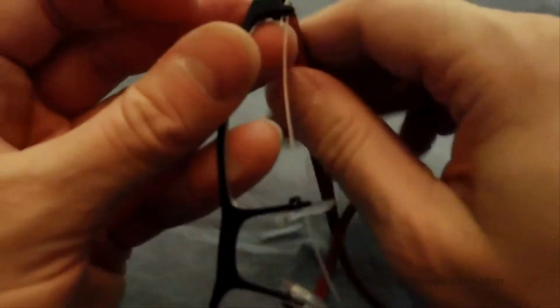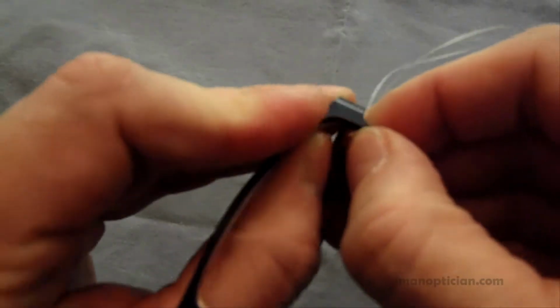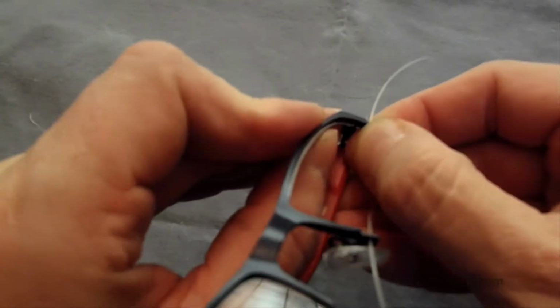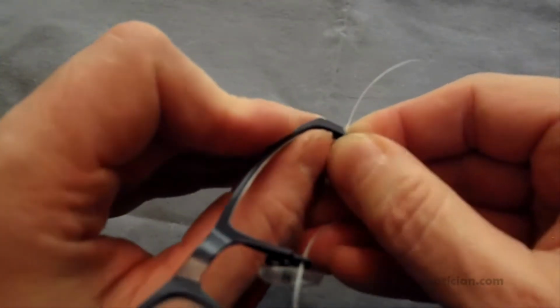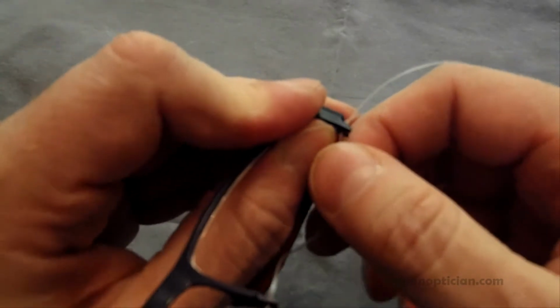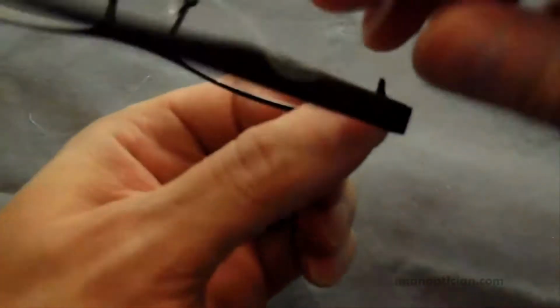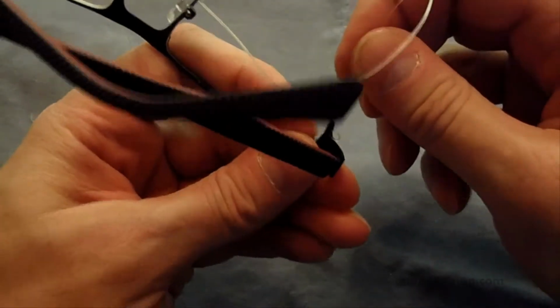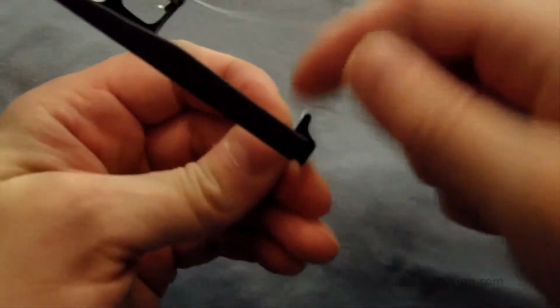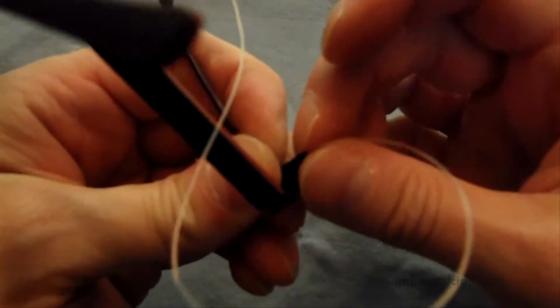And then you're going to want to leave a little bit of a tag and bend it over. Now you want your tags to not overlap with your figure 8 liner. You want it to come up to but not overlap. You can leave as much as you really have room to fit in there. The more that's there, the stronger this will hold and not pull out. And then you want to pull this nice and snug so that there's no loop on the outside, so it's nice and tight. And then pull that down so that it sits into the little notch there.